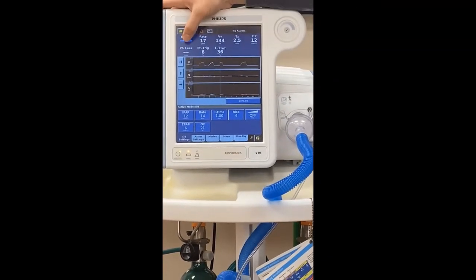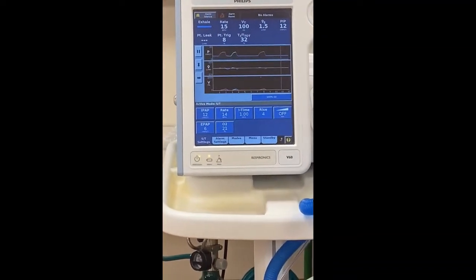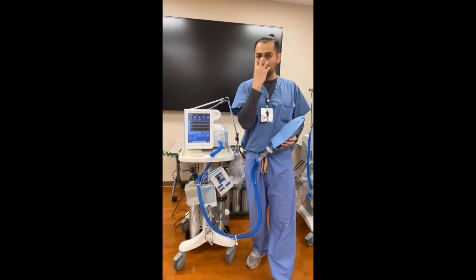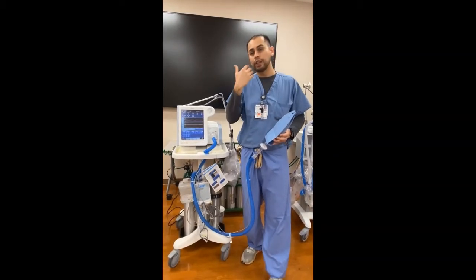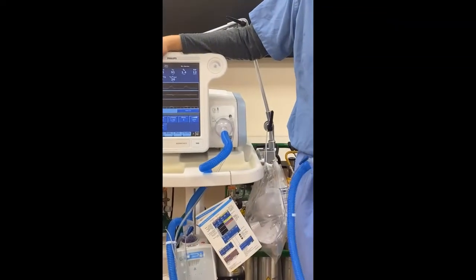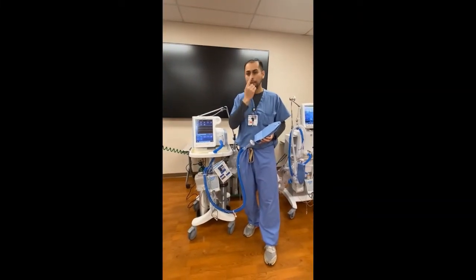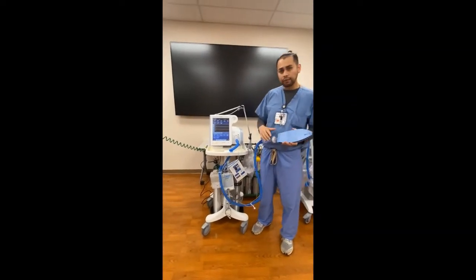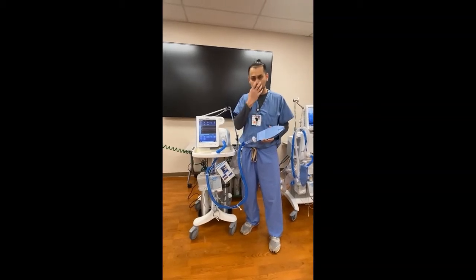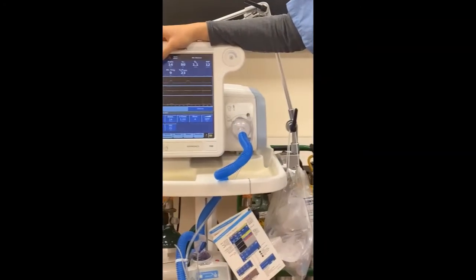A couple things down here, the most important is our leak. Out of these three, the patient leak gives us information on whether the mask is nice and sealed onto the patient. If the mask tends to go off to the side, a lot of that air is going to be leaking, and it'll get recorded here. We want to have a leak less than 50, which will give us a good seal, but not too tight on the patient, where we can cause some skin breakdown around the nasal and mouth area. So anything less than 50 is good. Anything higher, we definitely want to call RT to adjust the mask, or if we're able to adjust the mask, if it happens to come off, we can simply put it back on, and make sure that the leak is definitely less than 50.